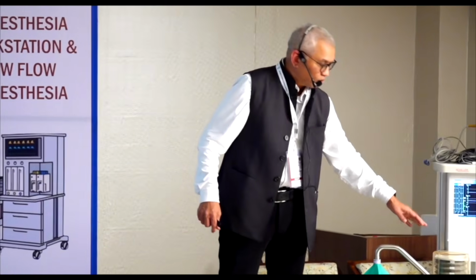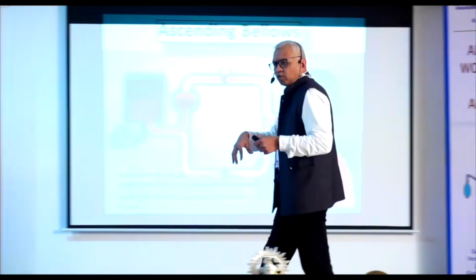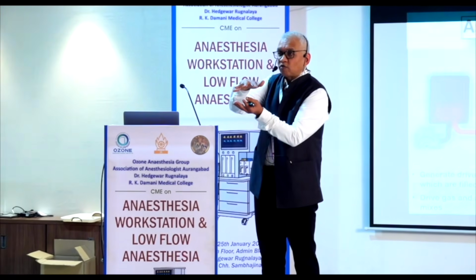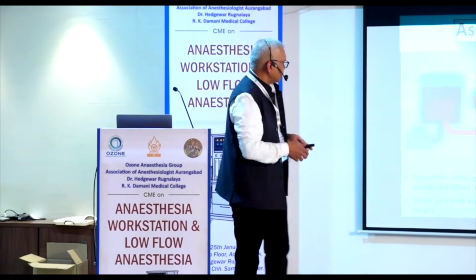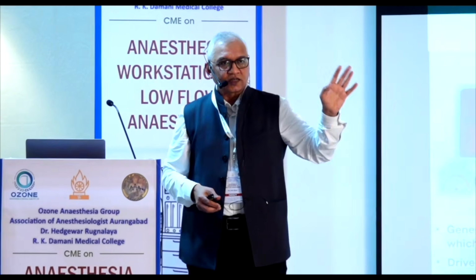Separate gas comes to squeeze this. Roughly, we can say that when you set a 500 tidal volume, 500 ml of separate gas comes and squeezes this bellow from the outside. So here, bellows are squeezed by a separate gas.